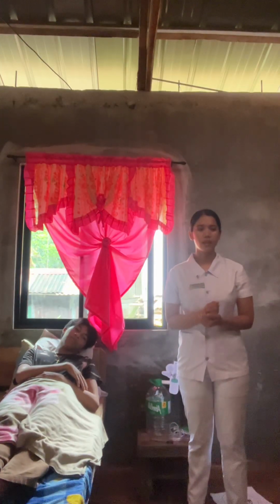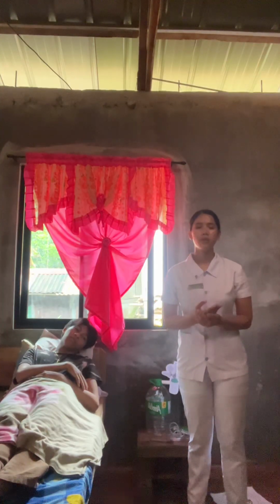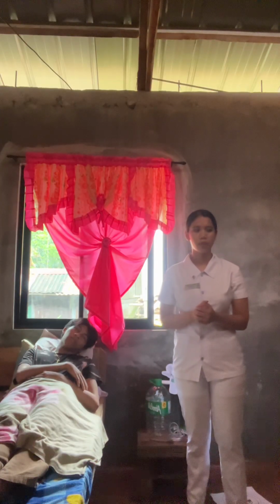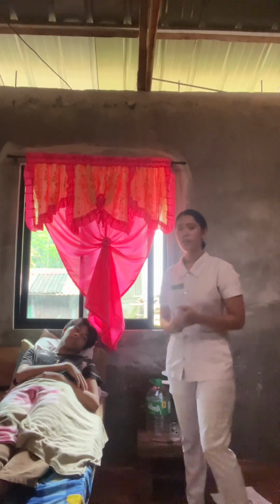The second is determine current arterial blood gases if available. Post a no smoking sign on the door of the patient's room in view of the patient and visitors. Oxygen supports combustion. There is always danger of fire when oxygen is used.